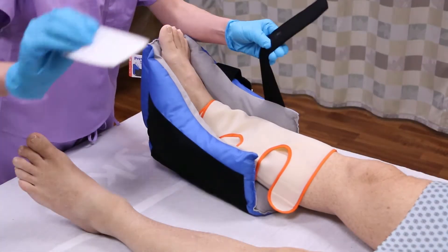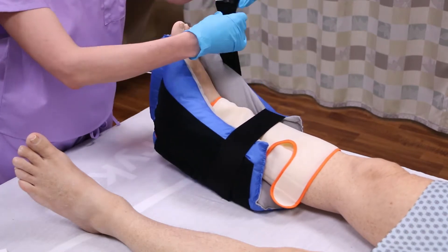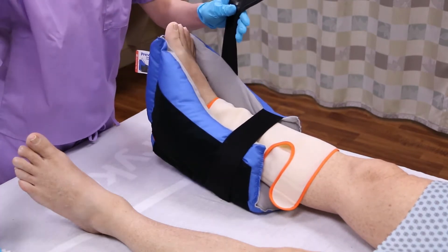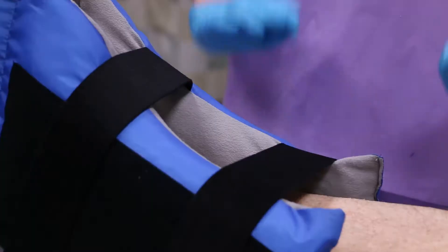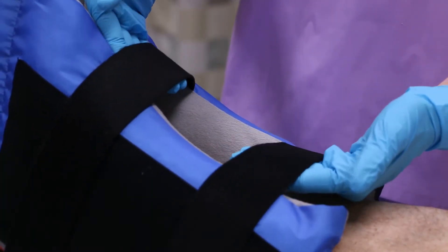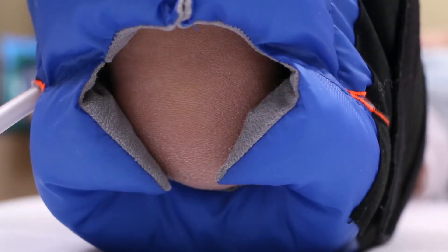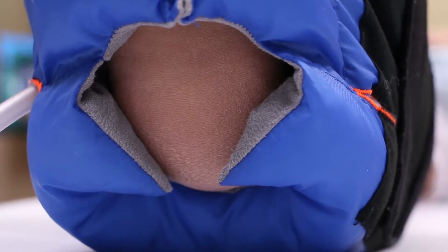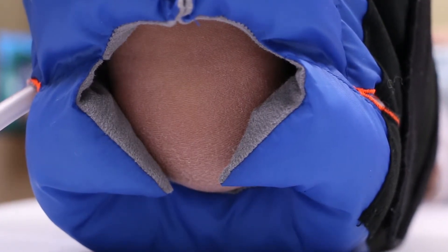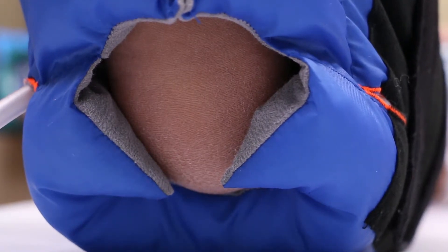The Prevolon Heel Protector 1 comes with two closure straps that adhere to a Velcro panel on the heel protector. When fastening the closure straps, make sure the straps do not come in contact with the patient's skin. Do not over tighten. Finally, make sure the heel is floated. Check by looking or feeling in the opening at the bottom of the heel protector. If the heel is not floated, reposition the heel and readjust the closure straps.